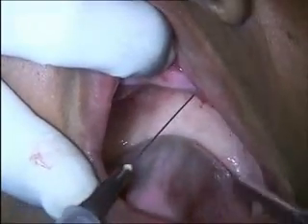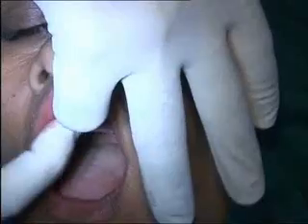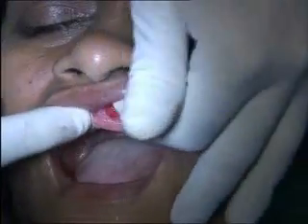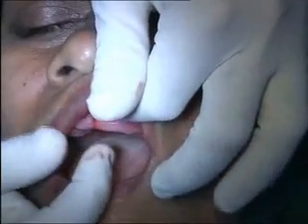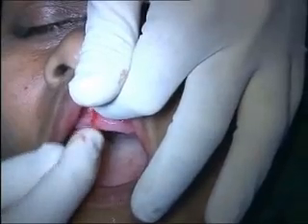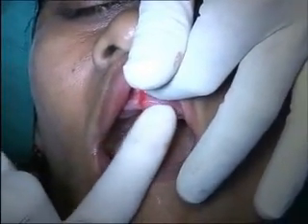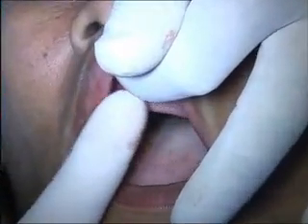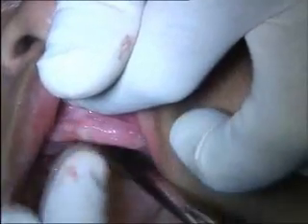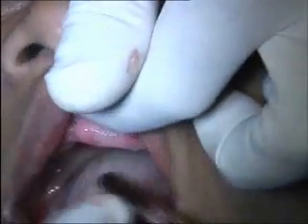Some doctors like to take the incision and go around the whole ridge, but I don't think that's necessary, because you're not going to place anything in the midline. Since no implant is being placed in the midline, there's no reason to allow the incision to go across the midline. I will bring it here to what you call the central incisor area and make a vertical incision. Similarly on the right side, I will do the same.